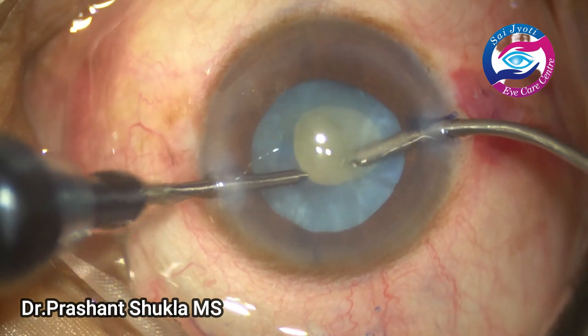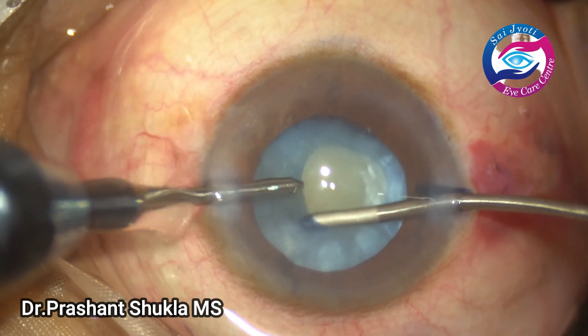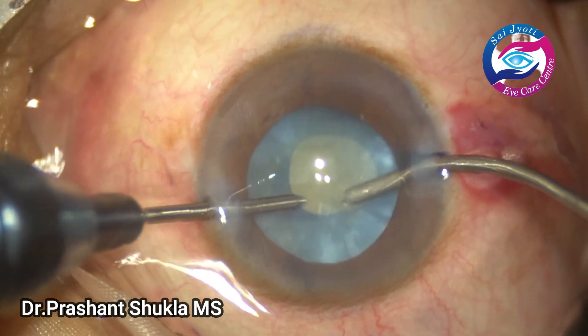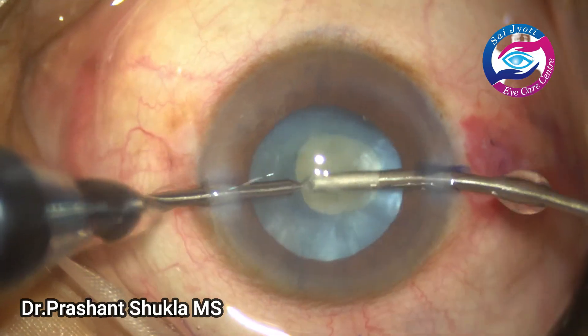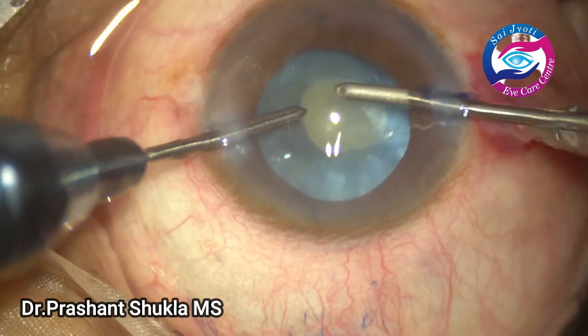The nucleus is gradually tapped and rotated so that whatever cortical matter is stuck behind the lens is expressed out and then aspirated.